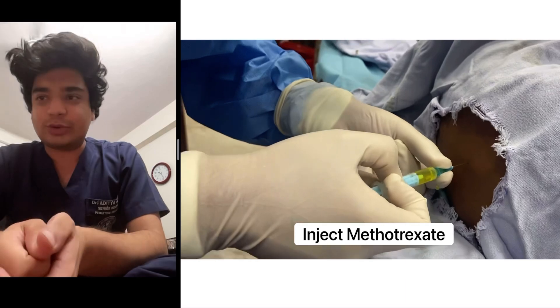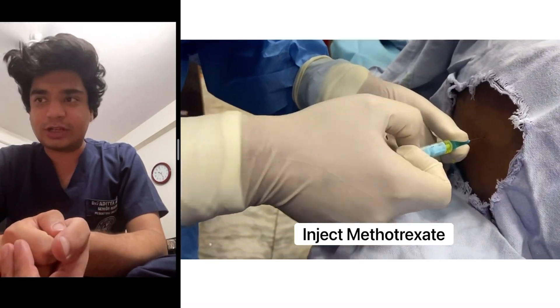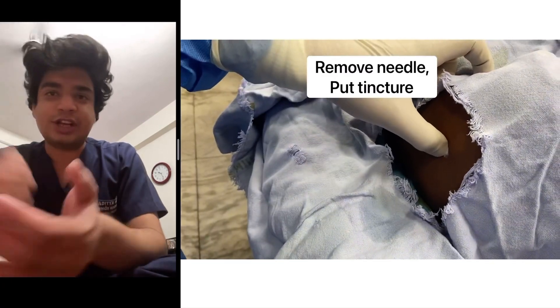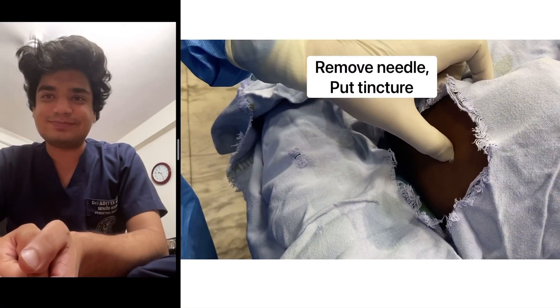Now inject the drug that you are going to give — that is methotrexate in this particular case. When you are done, remove the needle and apply tincture iodine. Thank you.